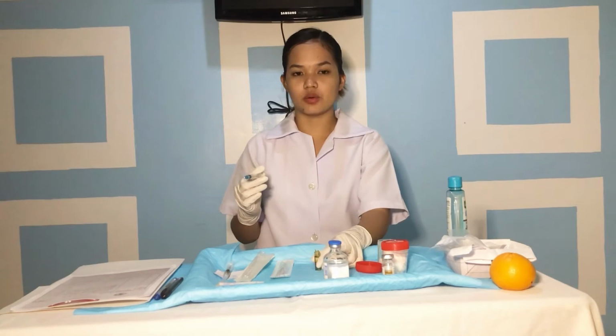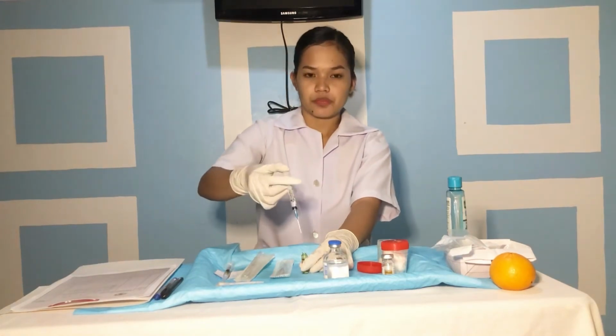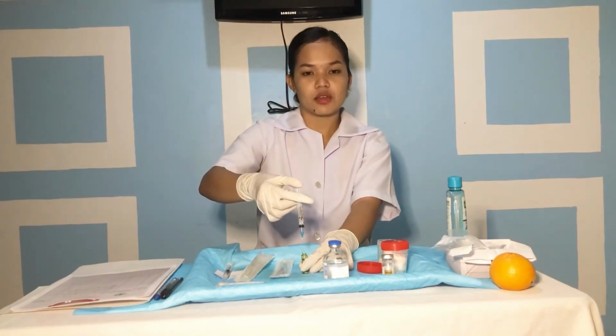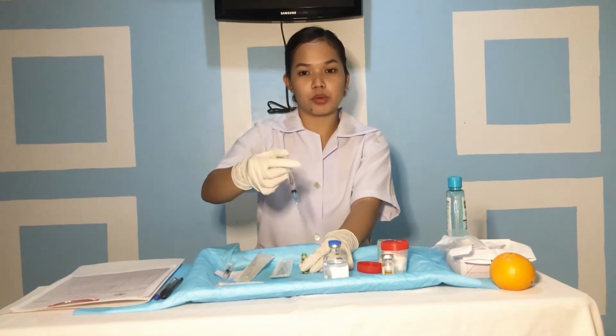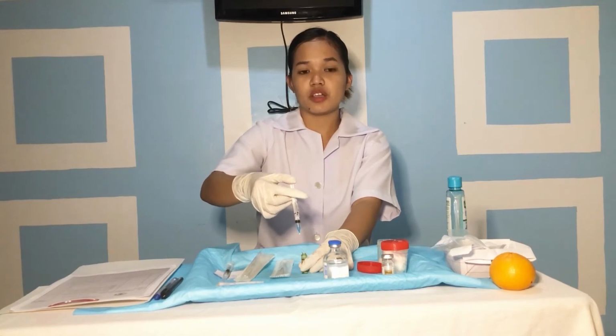We hold the ampule upside down or set it on a flat surface with the needle in the center of the ampule opening. Do not allow the needle tip or shaft to touch the rim of the ampule, because the broken rim of the ampule is considered contaminated.